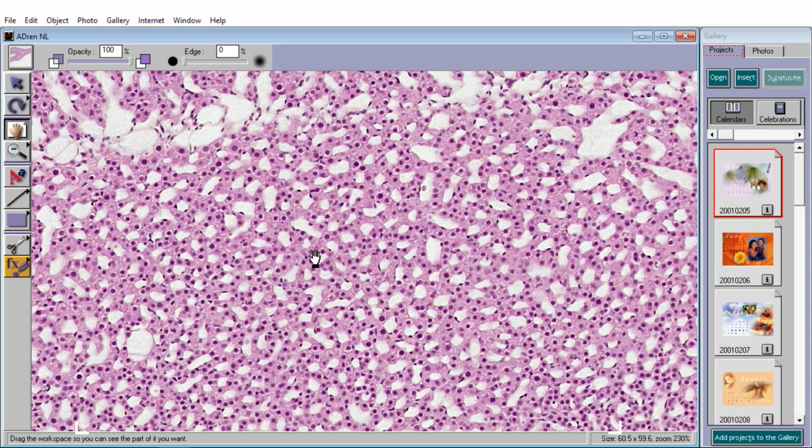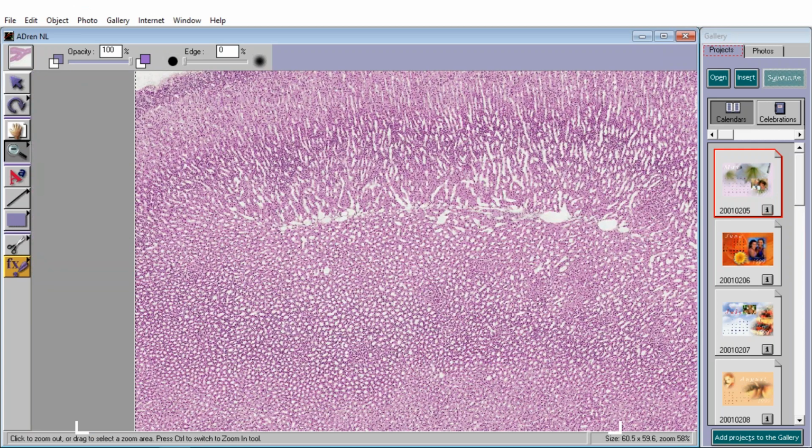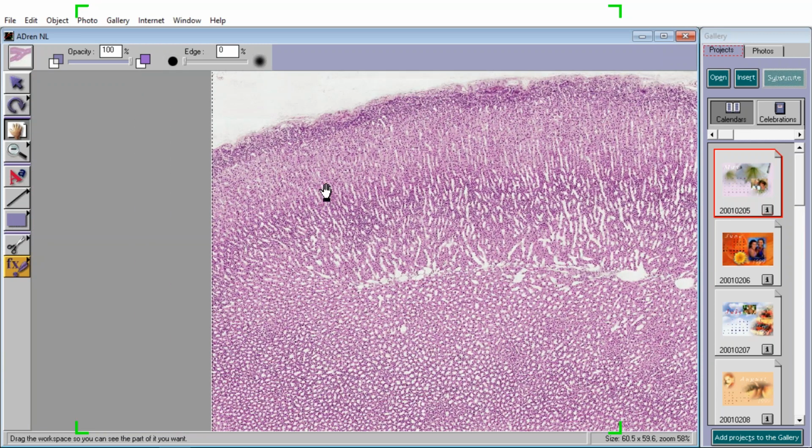And so, let's just say this is a normal adrenal, and I am going to pop it down again slowly. And I know, for example, that when I pop it down, within a second or two, all of you buzzards see it. I'll pop it down again, and now I'll drag it a little bit. And usually after I drag it within a second or two, everybody sees it. So there's the medulla, very big vascular spaces, but not very thick. And those are your 3 layers.